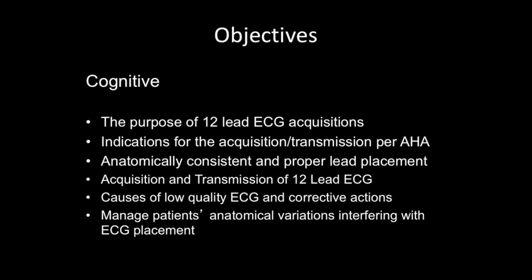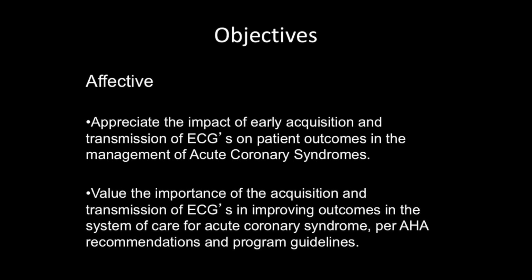Okay. So you're going to need to appreciate the impact that it has if we do this. Why are we doing this, right? There's a benefit to this in the management of ACS, acute coronary syndrome, and there's also a value in transmitting that is per the AHA. The AHA has shown, and there are studies that have shown, that if you transmit a 12-lead EKG to a facility and it changes where you take this patient, now to a cath lab if they have a STEMI, the patients tend to benefit from that.